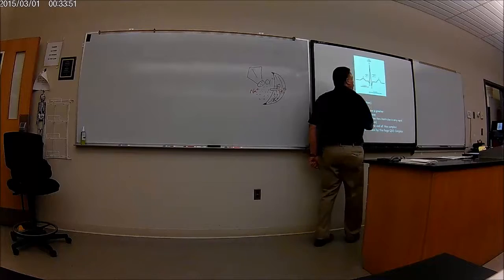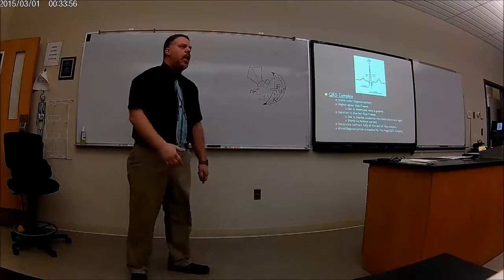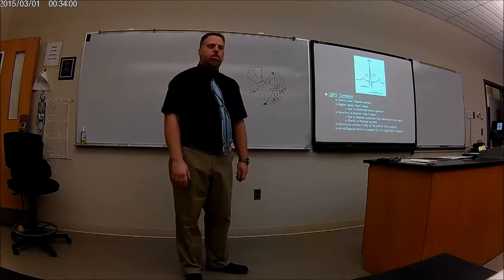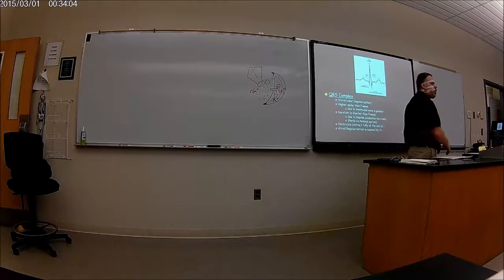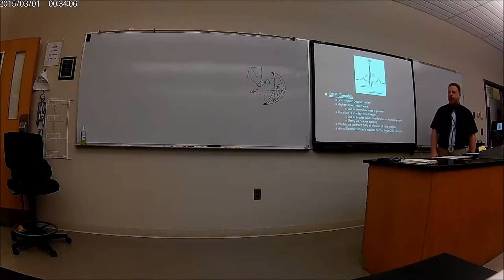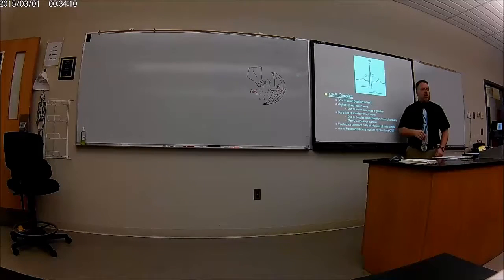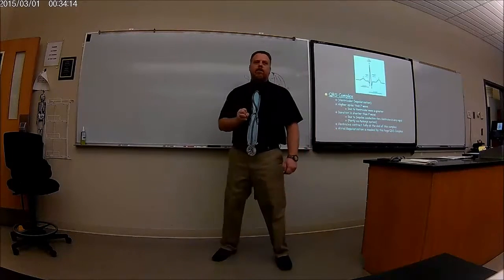This one's relatively short. Because electricity in the ventricles happens much quicker than in the atria. And it's partly due to the way the Purkinje fibers are set up. At the end of the QRS, the ventricles are fully contracted.